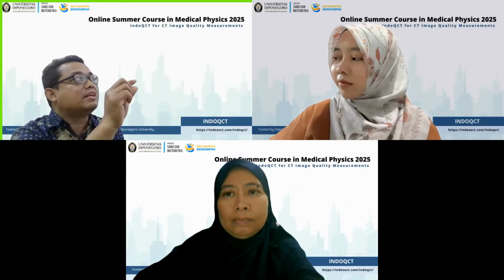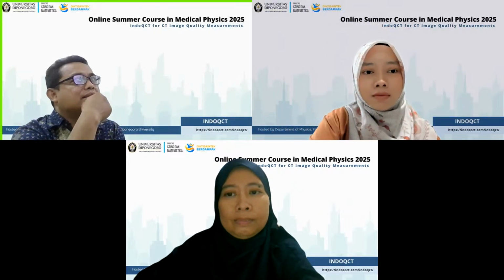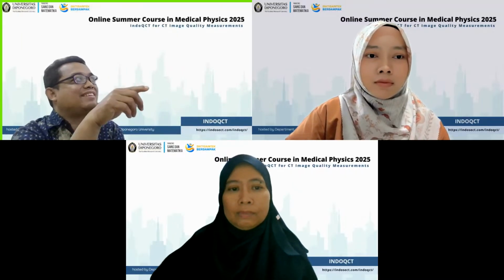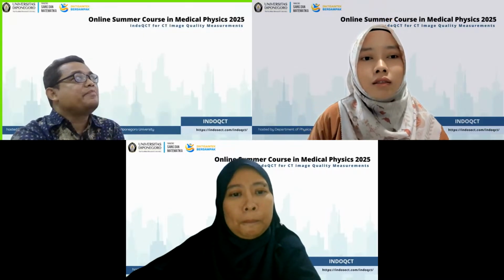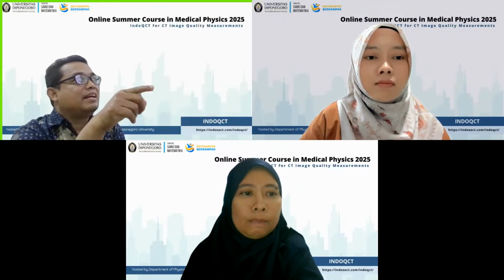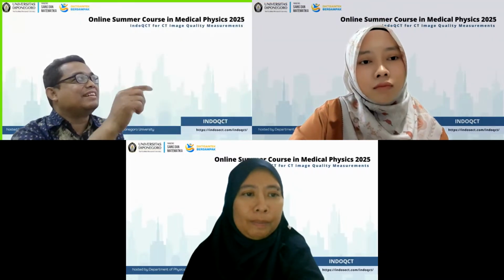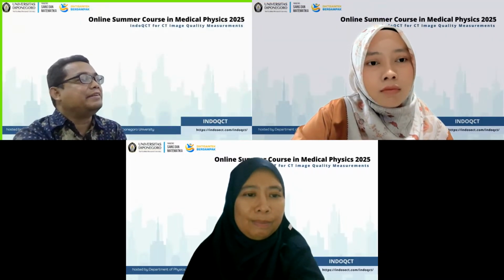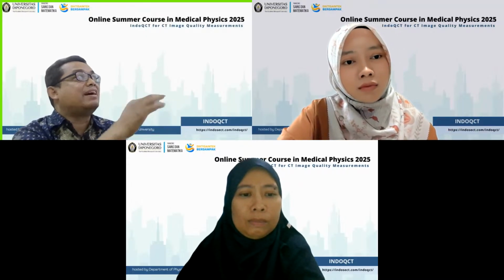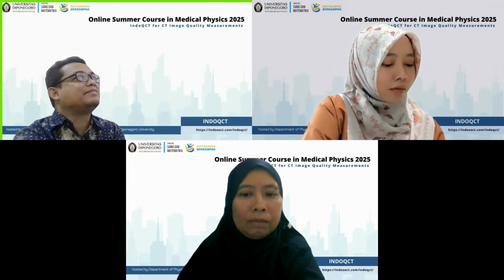In some papers, it is said that this is also prone to error. But if we use the TTF, the TTF is based on the ESF. So I think using the ESF is better, and now there are many mathematical functions to make the ESF better.